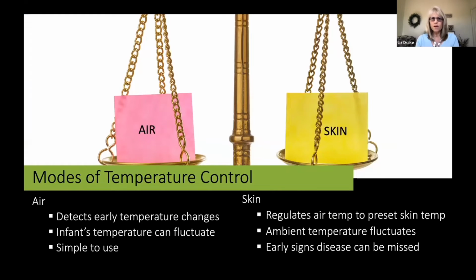So now we're going to get into the modes of temperature control, air versus skin. So which one do we use? Well, they're both accurate. They're both modes of temperature control that are effective. However, skin mode does require a little bit more focus and attention.